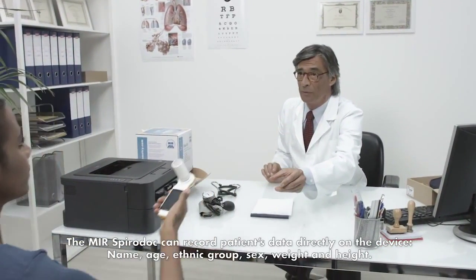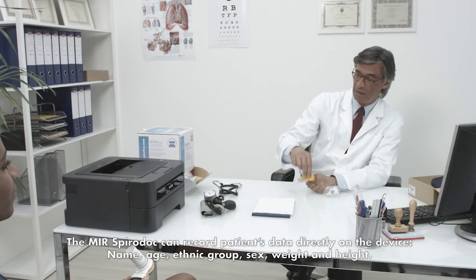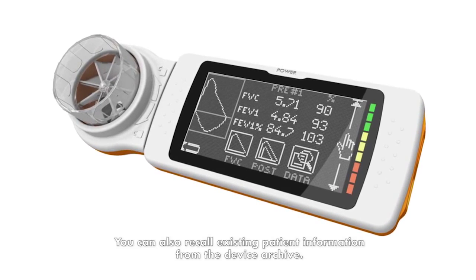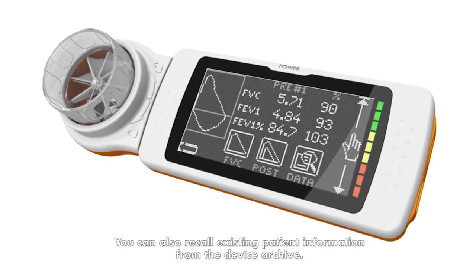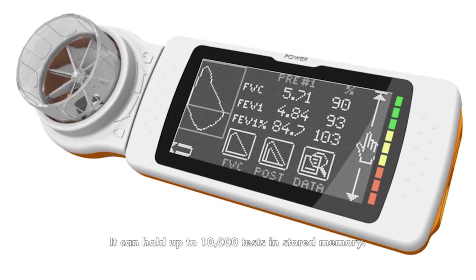The MIR SpiroDoc can record patient data directly on the device, including name, age, ethnic group, sex, weight, and height. You can also recall existing patient information from the device archive. It can hold up to 10,000 tests in stored memory.